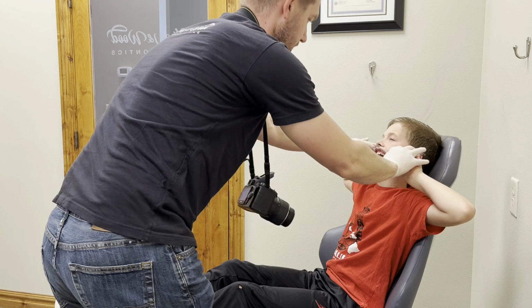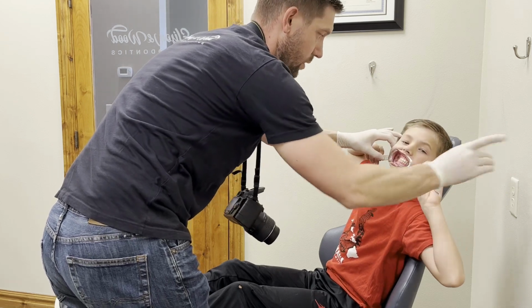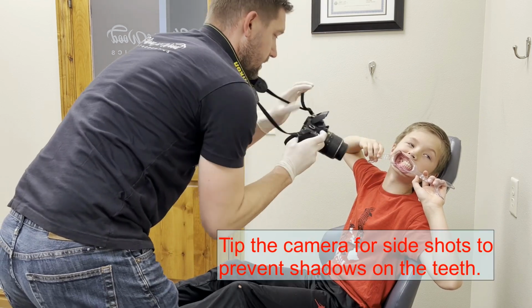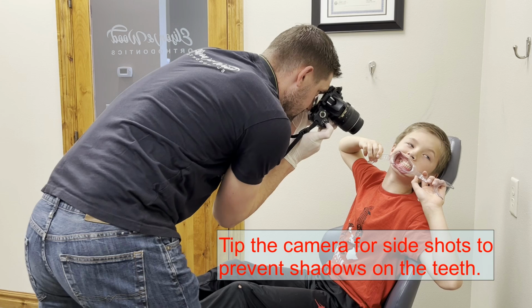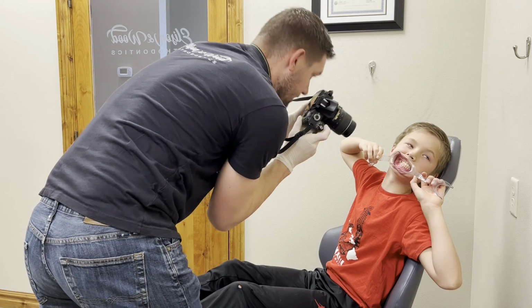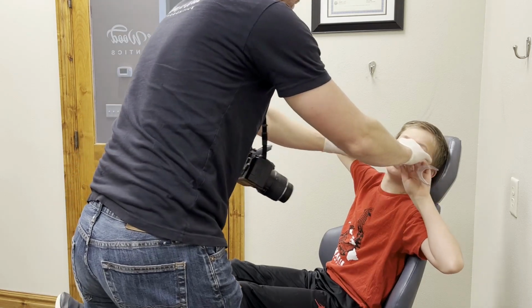Excellent. Same thing but the other side. Relax this one. Turn way over this way. And pull back hard, hard, hard. Just like that. Just stay just like that. Perfect. Excellent. Okay, beautiful.